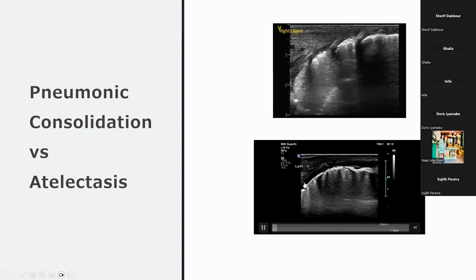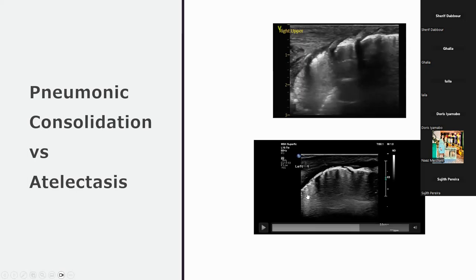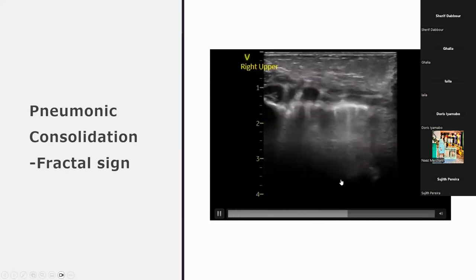So possibly consolidation, with a little bit of a pleural effusion, not enough to cause significant subpleural atelectatic lung, because it's just a rim, a very small margin. My debate when comparing these two is that this one is more likely to be consolidation with atelectasis, but here I've got an intact pleural line. At the moment it's consolidation, but the question from my perspective is, as this pleural effusion gets bigger, what will happen? That's where serial ultrasound and follow-up will help you make the diagnosis if you're confused. If not, get a chest x-ray. Why not use the best of both worlds?